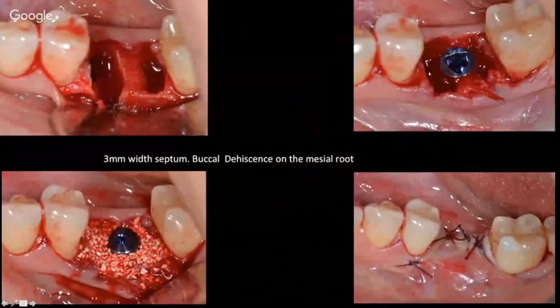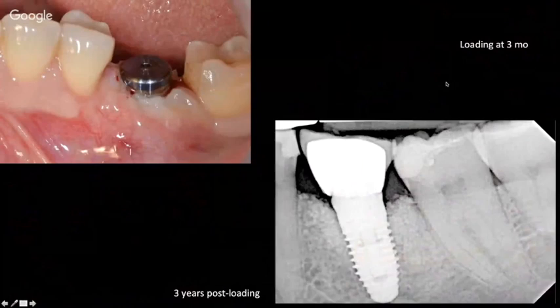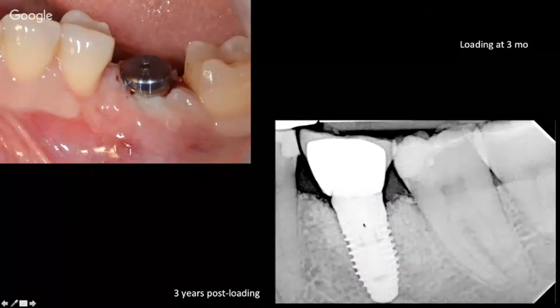What if we have a dehiscence on one of the roots? Can we still place the implant immediately? Yes, we can — in an ideal position using the same drilling sequence described. Fill the residual defect with bone. If it is a contained defect, we do not need a membrane; the socket will heal properly without one. Even with a small dehiscence on the mesial root, the bone placed in the residual socket is sufficient to support the implant and achieve good bone-to-implant contact. Close the wound primarily to prevent material loss.